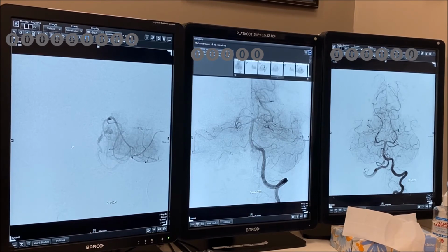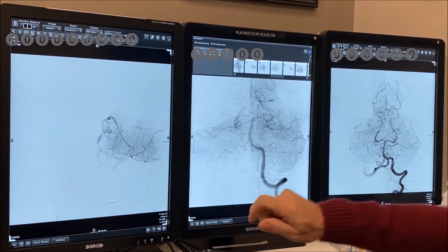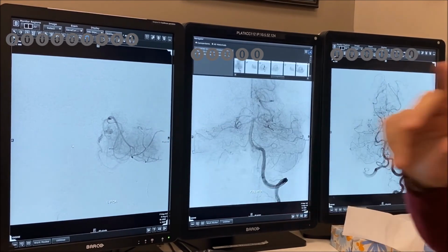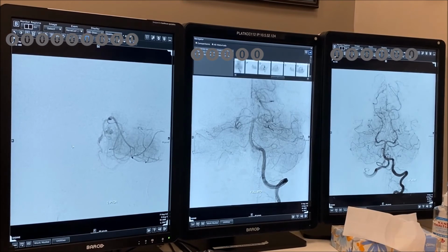A couple of things also. While you're doing this balloon, one other thing they could have done, I don't know if they did or not, although Howard probably did because he trained with me. You have the balloon now. Now I inject the PICA and I come all the way to that upper part and I stop injecting and I see washout. I'm blocking this thing here. There are collaterals like this. So I inject, and the moment it gets to the collaterals, I will see washout of my contrast. That would be an assurance that there is flow. Make sense?